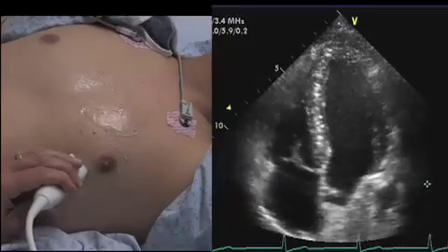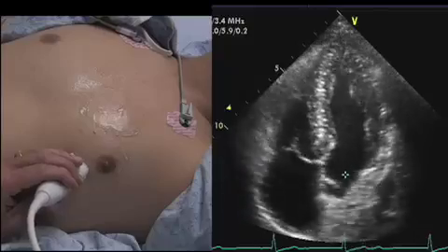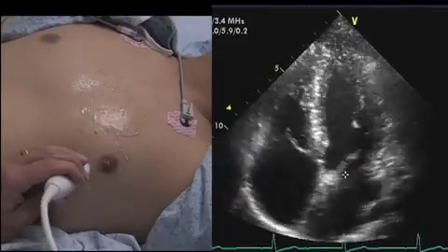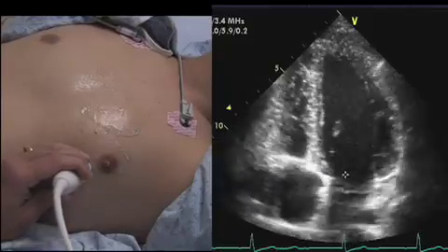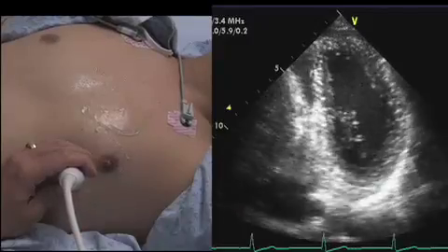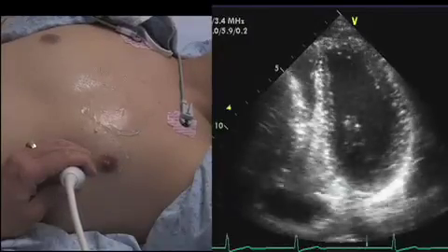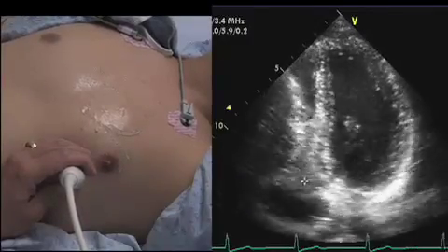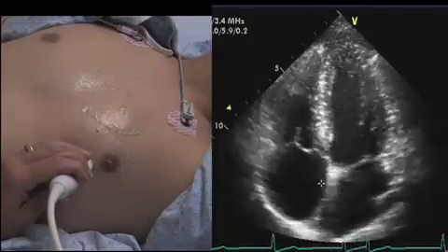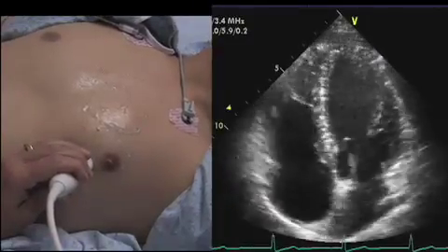To summarize: too anterior and the aorta comes in, moving us toward the apical 5-chamber view. Too posterior and the coronary sinus comes in — that's not a good apical 4-chamber view. So this right here is the best apical 4-chamber view.